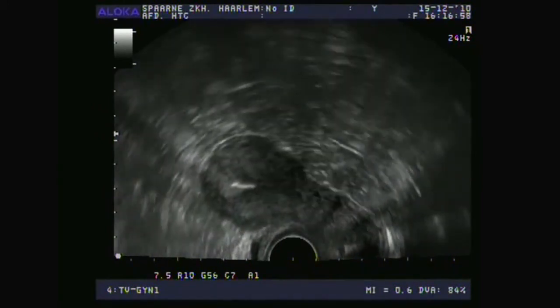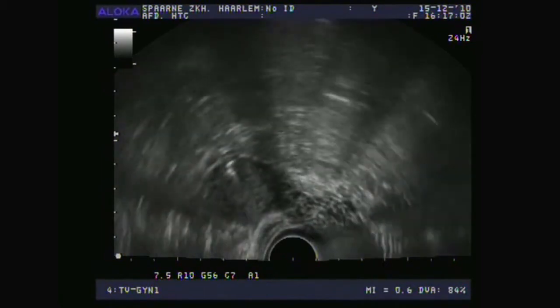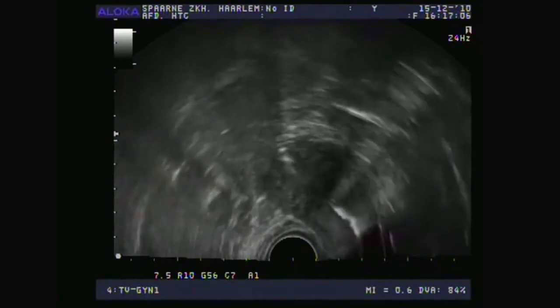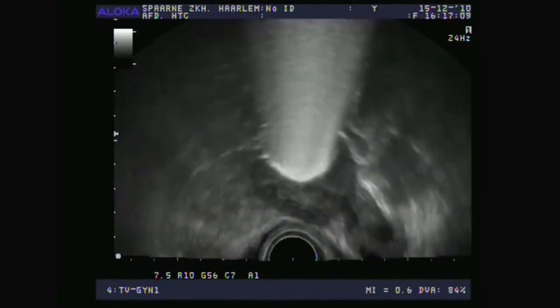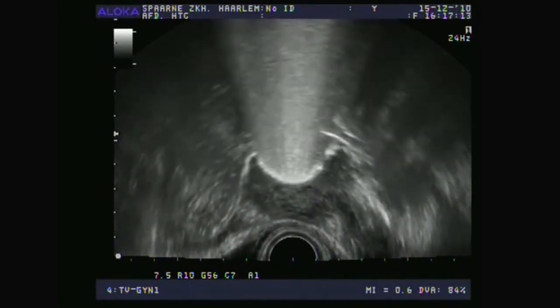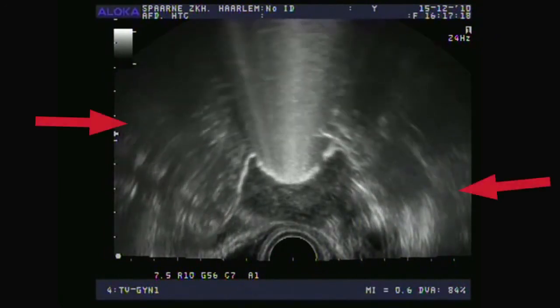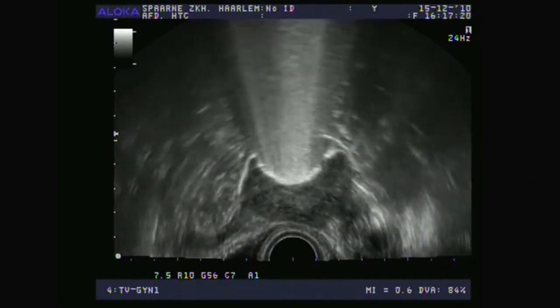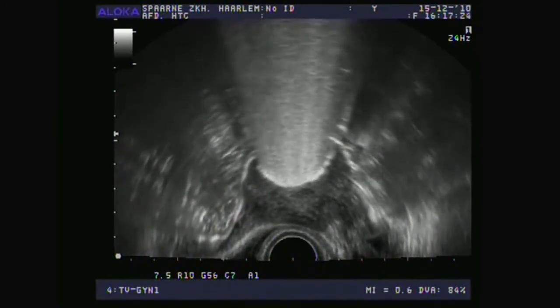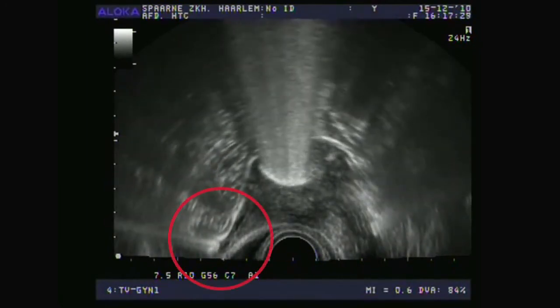I inserted only a tiny little bit of the foam, and you can already see that it flows straight to the fundus. Now I'll turn it a little bit to the left and to the right, and now I'll turn the probe about 90 degrees from a longitudinal cross-section to a transversal cross-section. Here is the transversal cross-section, and you can see that the right fallopian tube is filled immediately. We then focus on this right fallopian tube, where you will see the foam appear in a moment. It will really overflow into the abdominal cavity.